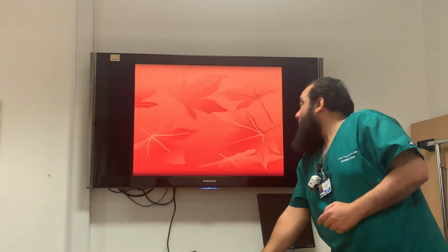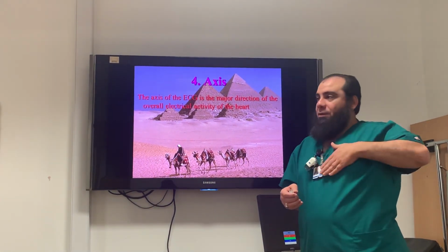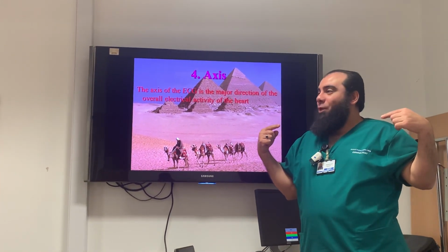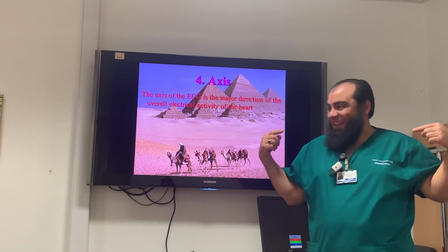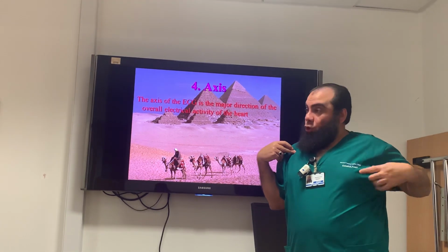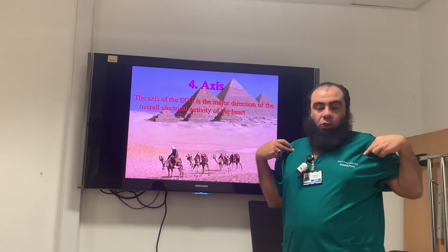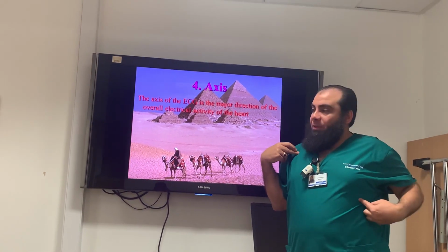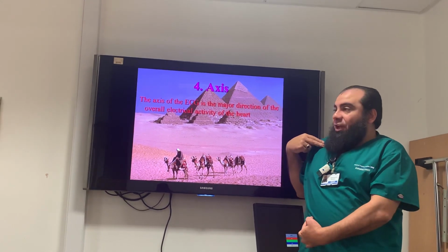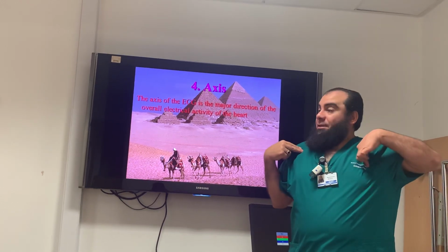Okay? Good. Axis. What's axis? The heart is here. Do you remember the boring first lecture? Here is aVR. Lead 1 comes here. It's not here physically, but it records the heart from this side. aVL records from that side. Lead 2 records from that side. aVF is like the stomach view. And lead 3 is just at the base, but a bit to the right side. This is how you see the axis.